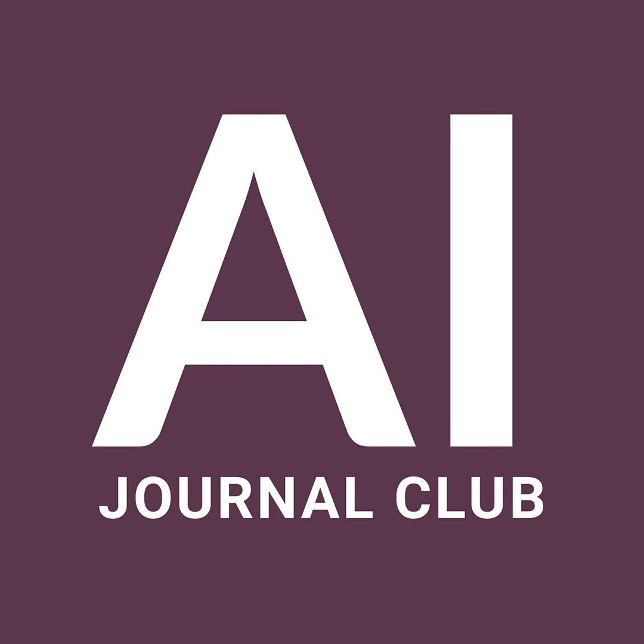Okay, I have to ask a practical question here, though. If the algorithm is incredibly sensitive, designed to find absolutely every suspicious cluster, doesn't that risk overflagging anomalies? That's a very fair point. Because if the computer is constantly tapping the doctor on the shoulder saying, look at this spot and this spot, it feels like it could actually create more work for the human who now has to verify every false alarm. And that is a fundamental concern when designing any medical screening tool. You have to balance sensitivity with specificity.